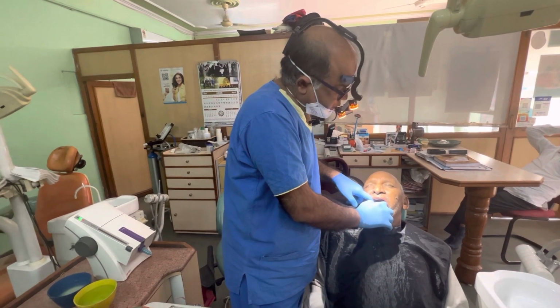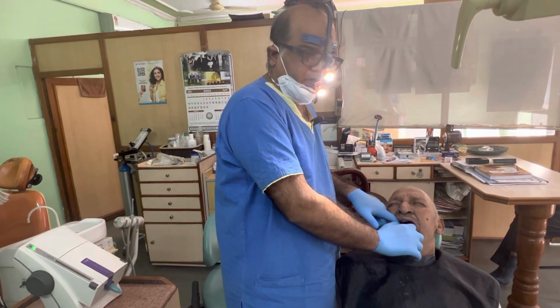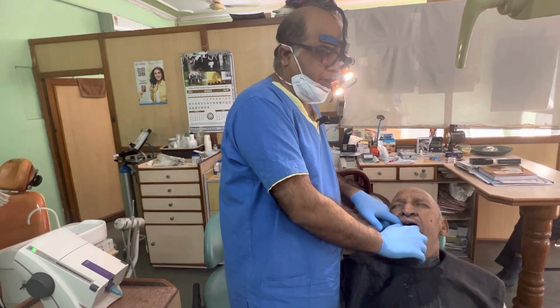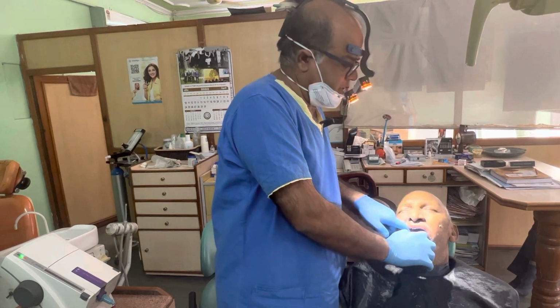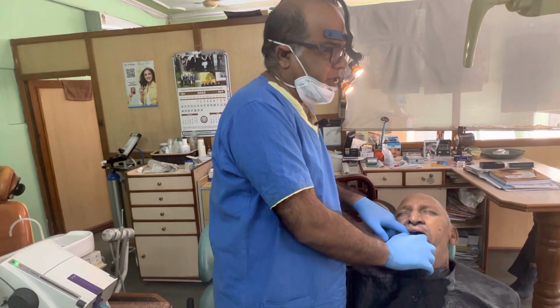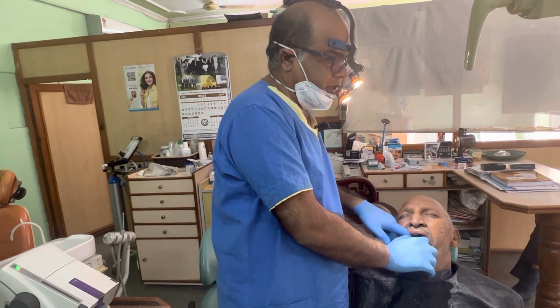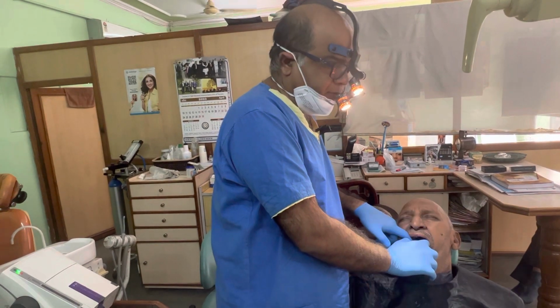So the basic thing one should follow in making any type of impression: apply petroleum jelly over the lips and perioral area so that the impression material doesn't get stuck to the patient's hair and other areas, so you can easily remove it.